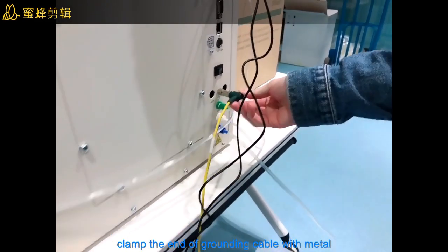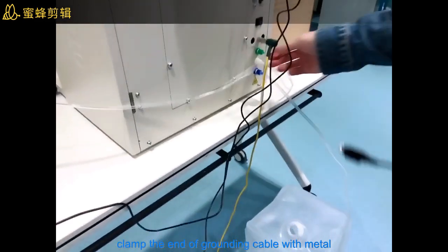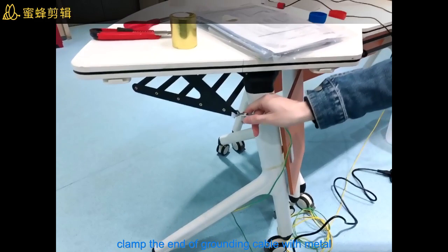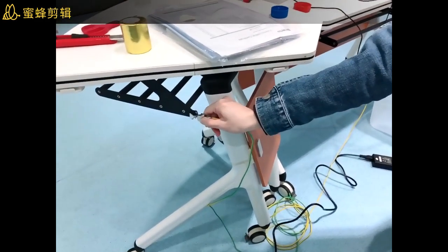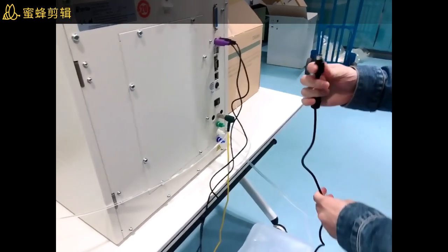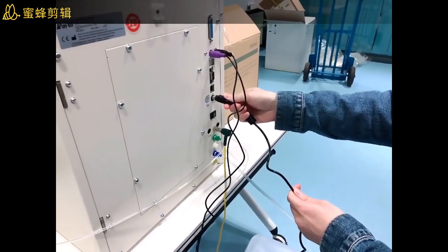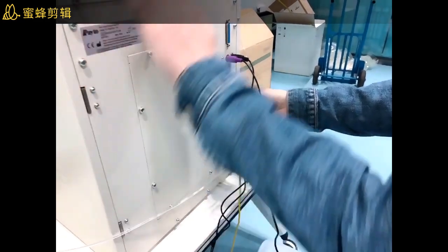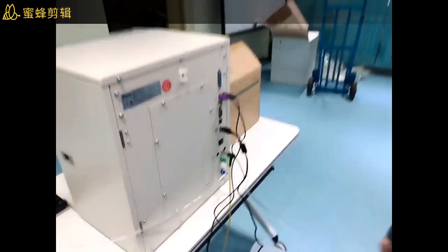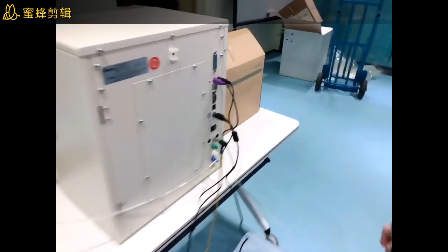For the ground wire, the other side you need to put it inside something like iron — the ground wire. And also connect the power. Once everything is ready, you can open this button.